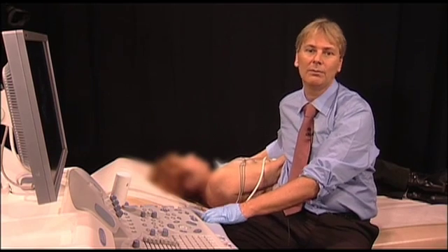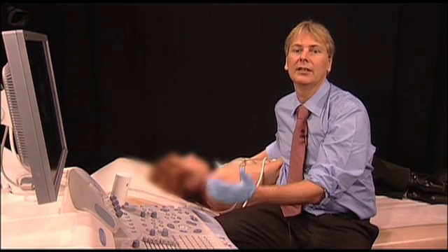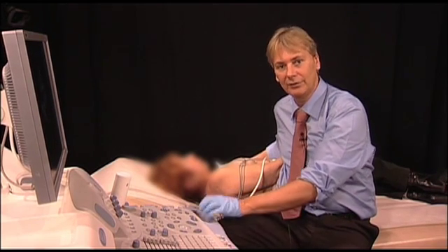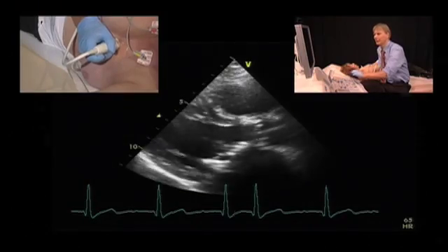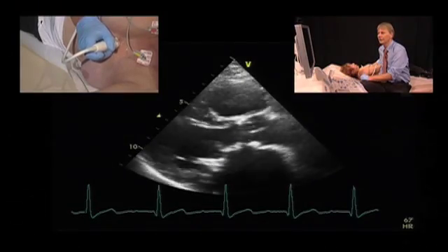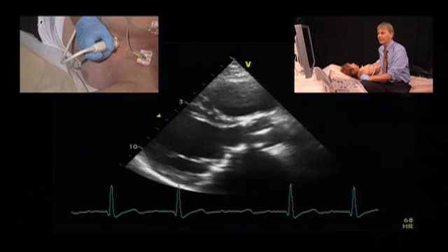This is a patient with a normal bioprosthetic aortic valve. The patient also has a mitral valve, also a bioprosthesis. Now let's first take a look at the aortic valve and the features of bioprosthetic valves.